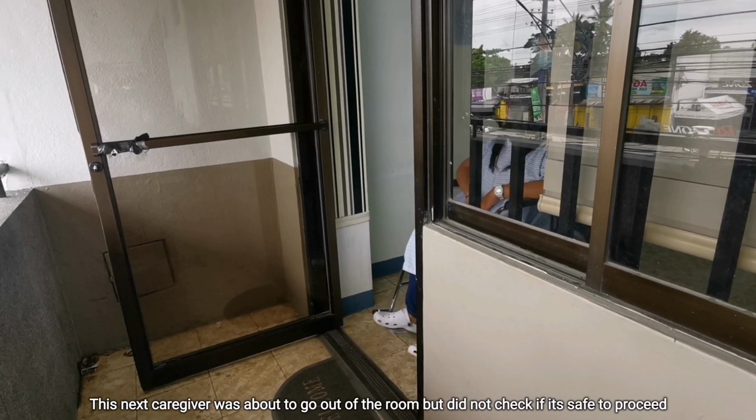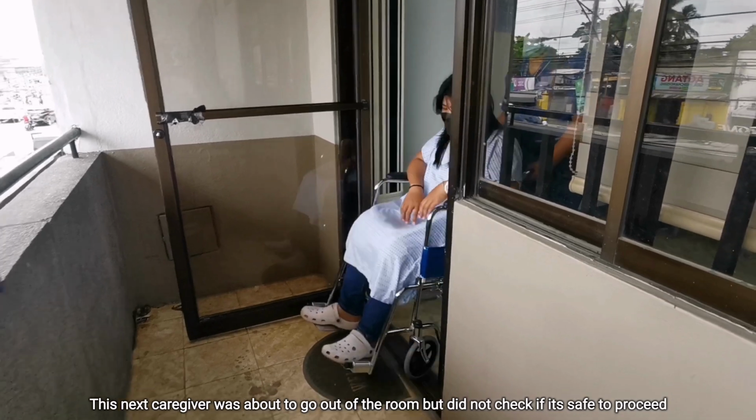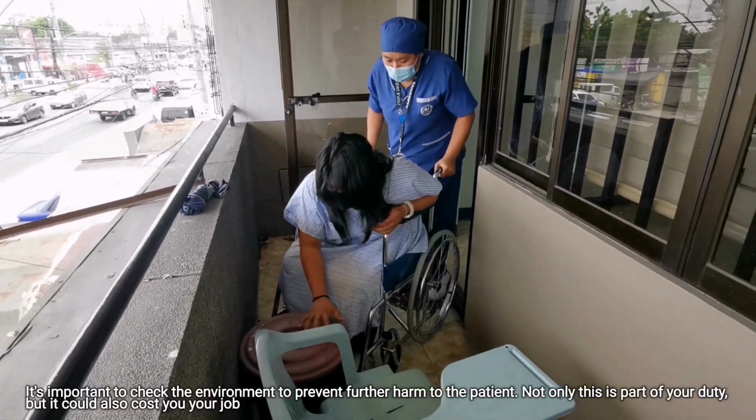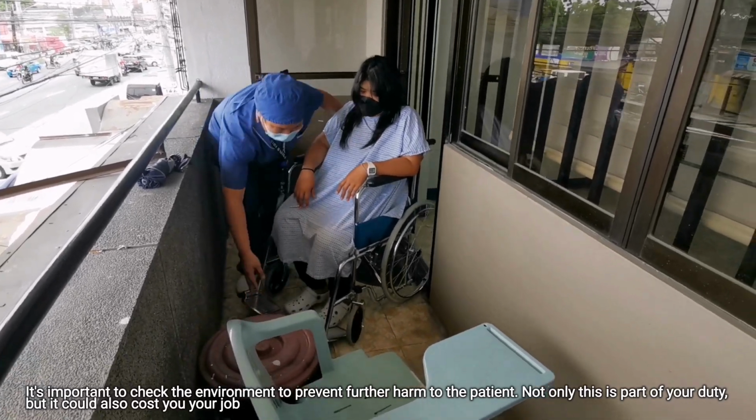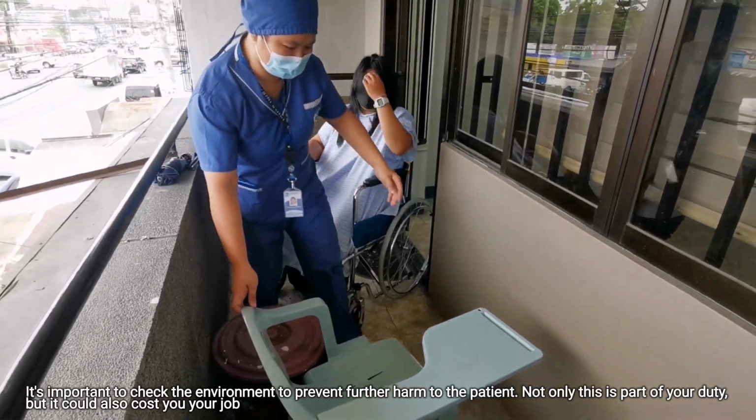This next caregiver was about to go out of the room but did not check if it's safe to proceed. It's important to check the environment to prevent further harm to the patient. Not only is this part of your duty, but it could also cost you your job.